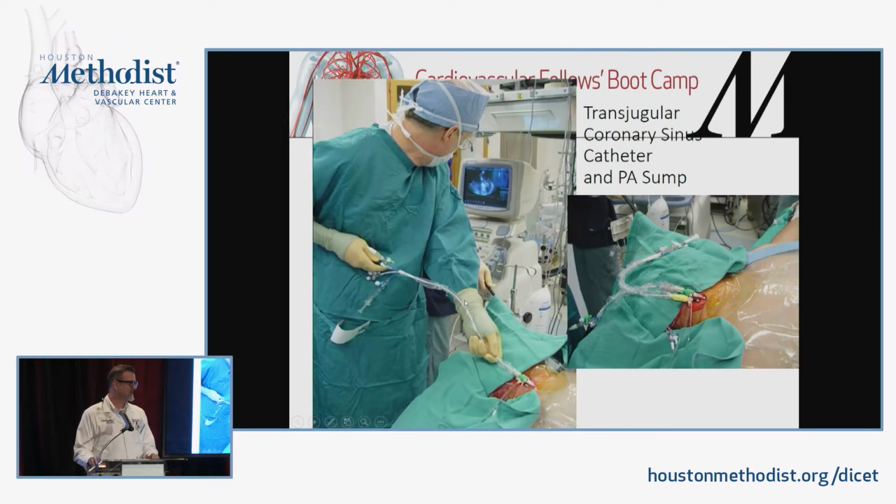But what's interesting is that a lot of anesthesiologists are doing these, and they can become very facile at putting in retrograde and sumps through doing TEE. And everybody does TEE now. So I do TEE on every single CABG I do. I mean, does it help? I think it helps coming off bypass. You look at the ventricle and see how it looks. And then you can look at other things. But every single time, does it help? No. But I think it definitely adds to the case.